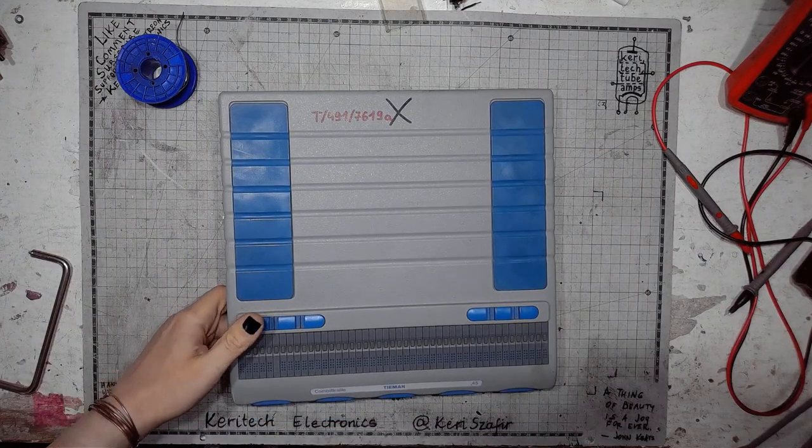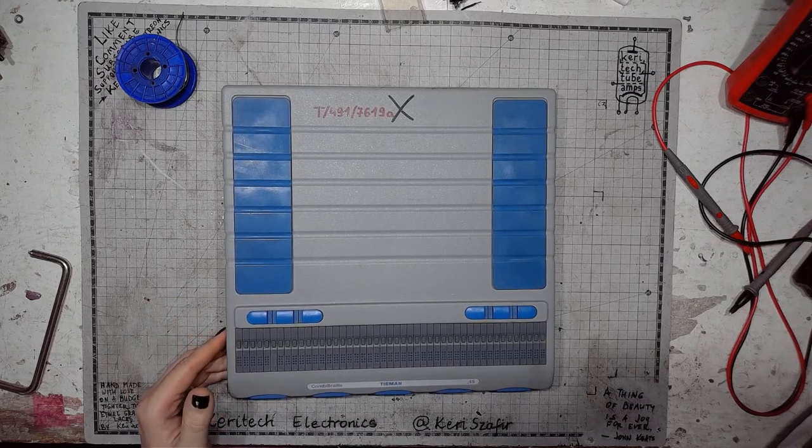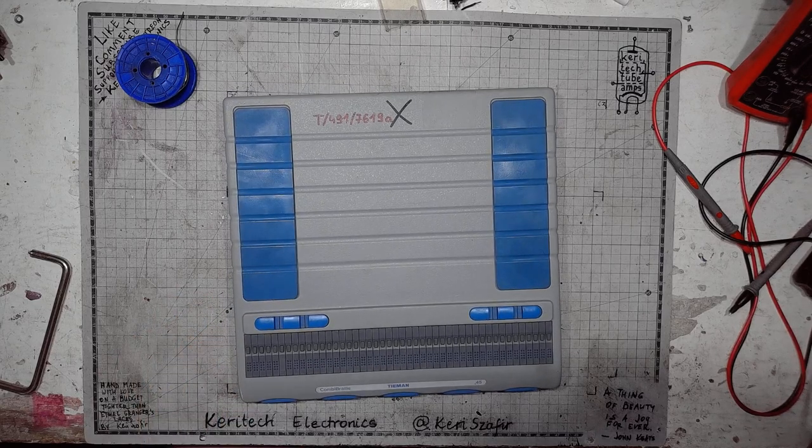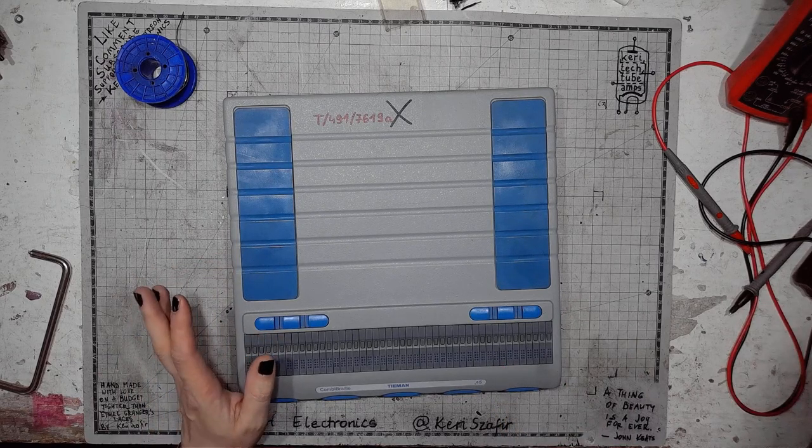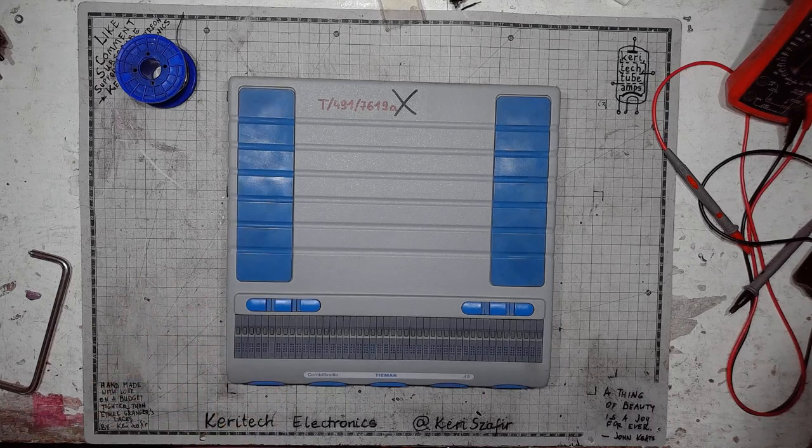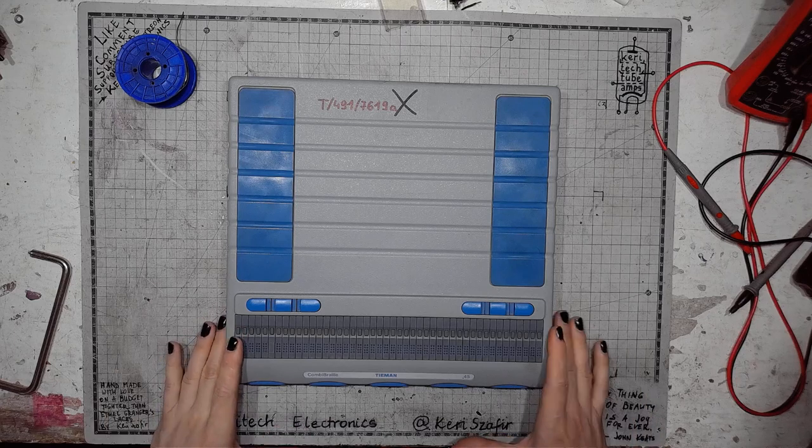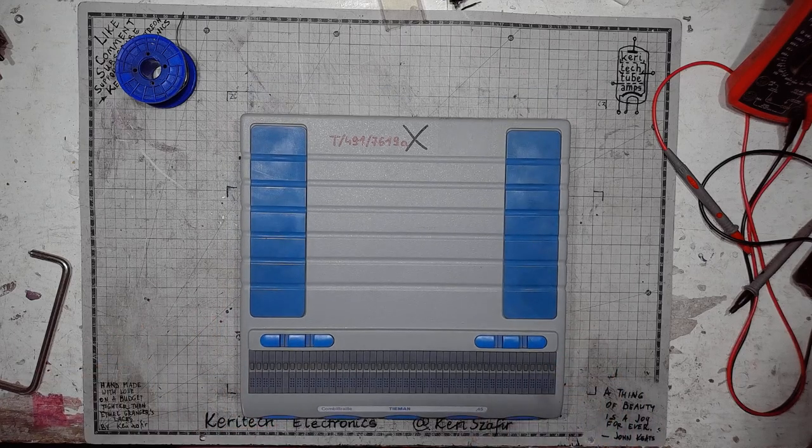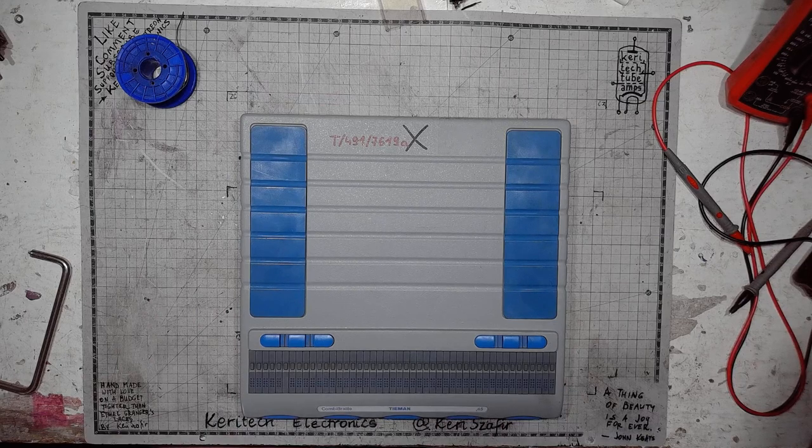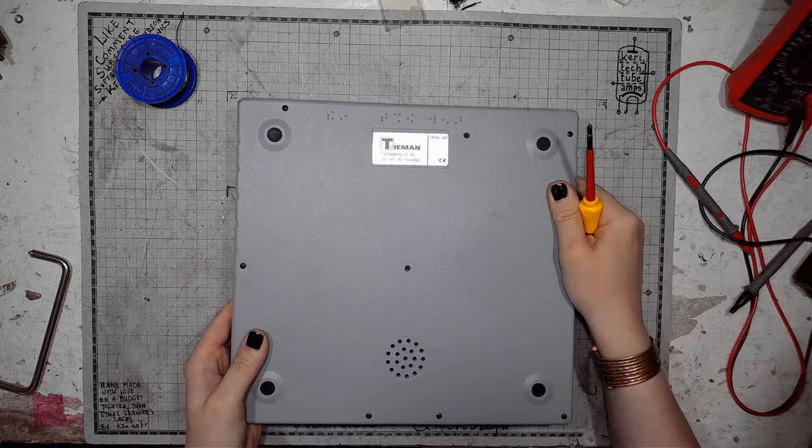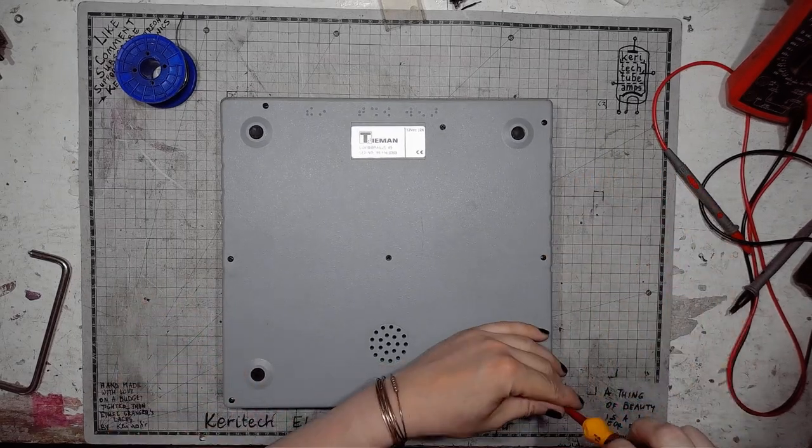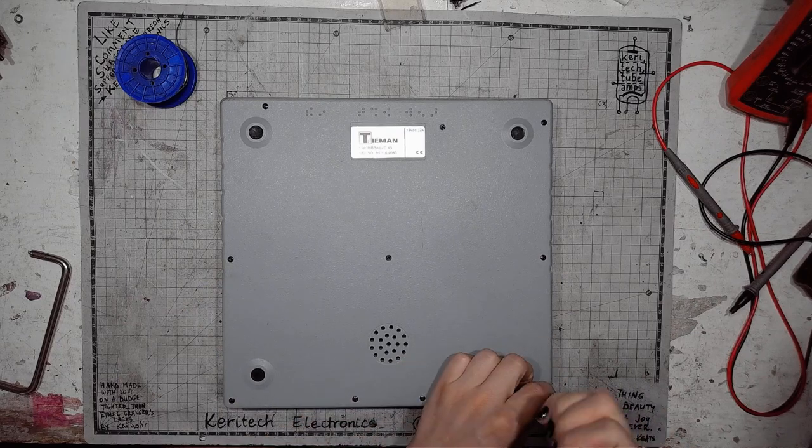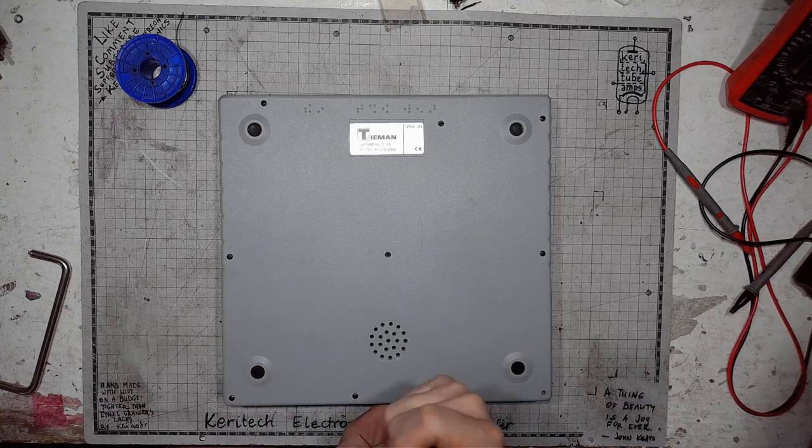I got this thing of beauty from the local fab lab, and there's some very interesting, high quality electronic engineering inside that I would absolutely love to show you. So let's get a screwdriver. There are a lot of screws on the bottom part. Let's unscrew it.